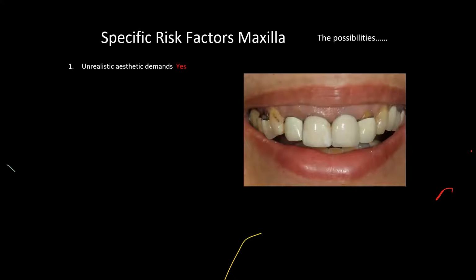does she have unrealistic demands? I think most people have. Okay, and our smile line height is not a vertical maxillary excess, and lip symmetry. It's a symmetrical lip. That's a great bonus for this case. Okay, you can't see the symmetry on the articulator, I'm afraid. You've got to see this in the mouth directly when you visualize it. Articulator will come later on in the treatment.